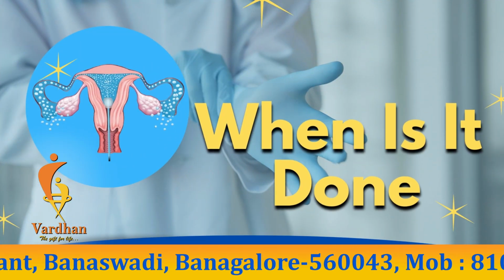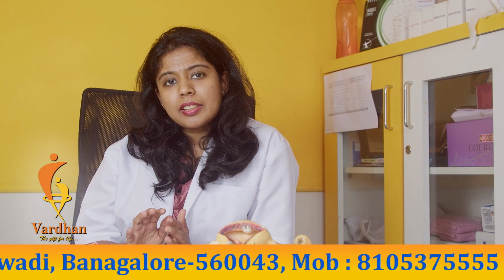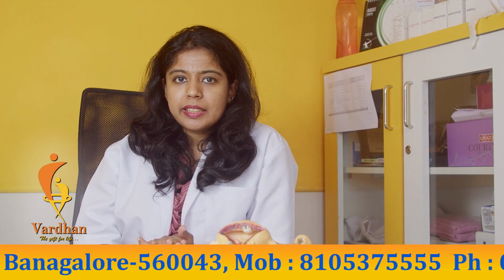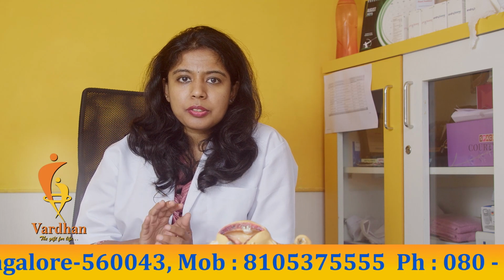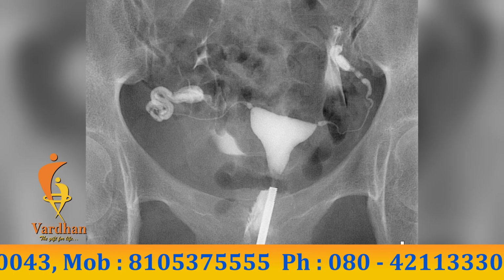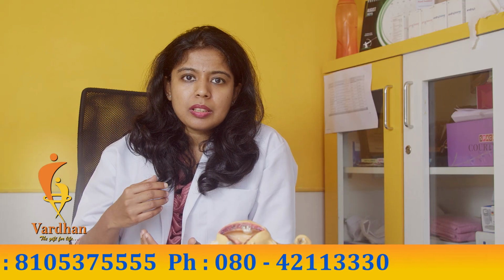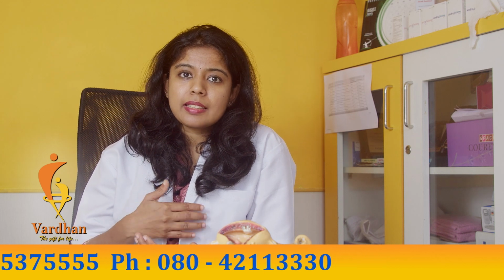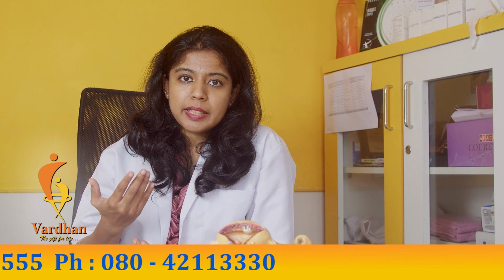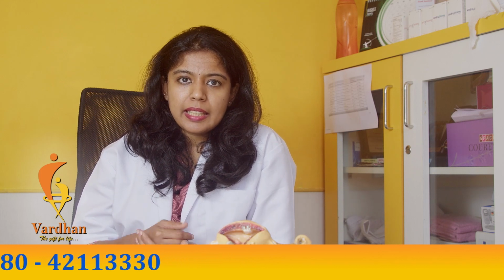When is it done? This test is ideally done when the bleeding stops completely, usually around 7 to 10 days of your menstrual cycle. It is not done beyond that because this is an X-ray procedure, so there is a risk of radiation. After 10 days you may have ovulation, which may affect the growing egg, and if there is a pregnancy, it can affect the pregnancy. So this procedure is done before 10 days.